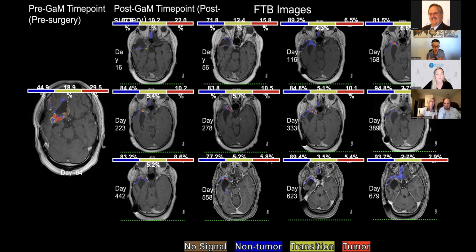The recommendation that we gave allows for acquisition of the DSC perfusion within the context of just your normal brain scan. So it doesn't require any additional gadolinium contrast agent. It basically just requires a power injector, and the pulse sequence itself is very widely available.